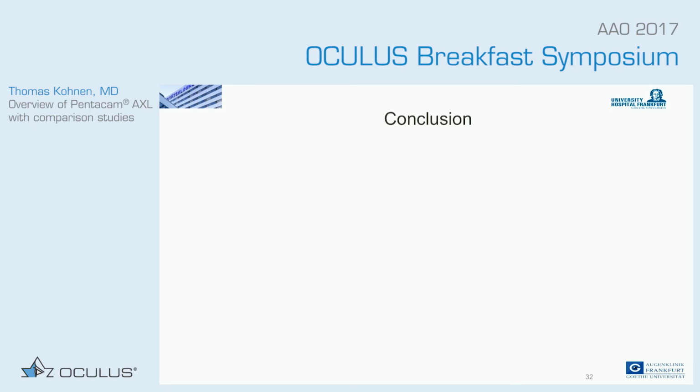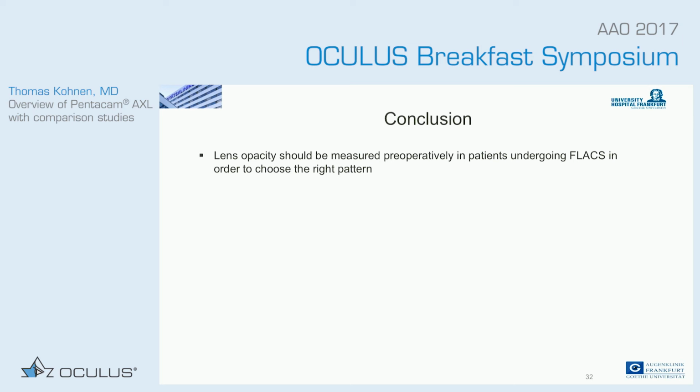And I'd like to conclude, for the Oculus device here: lens opacification should be measured preoperatively in patients undergoing femtosecond laser cataract surgery in order to choose the right pattern. Can be a statement, you don't have to do it, but I think we basically go in this direction. Scheimpflug measurement shows high repeatability when it comes to corneal evaluation.